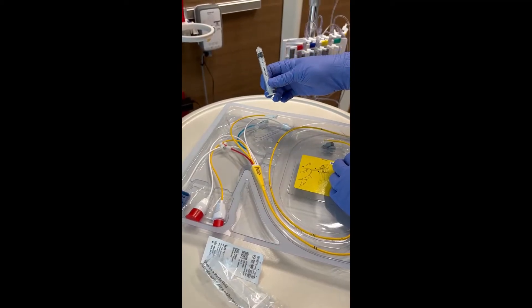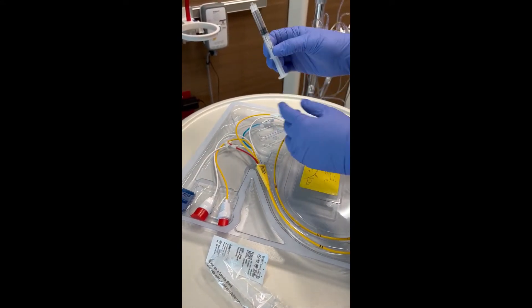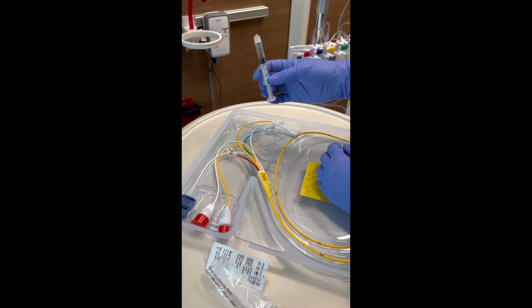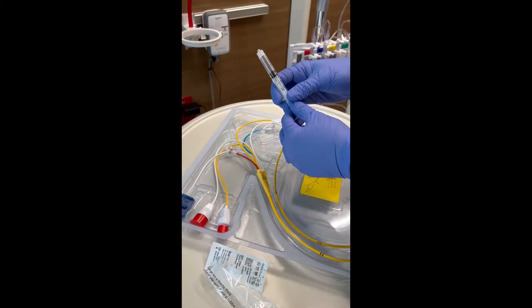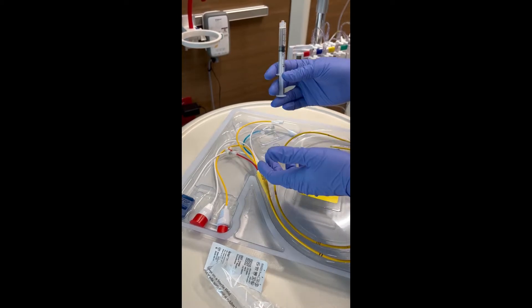This is the syringe that comes with the Swan. It will only draw back a milliliter and a half of air. That's the limit for this balloon. So you always want to make sure that your syringe locks and it's not just a plain three milliliter syringe.